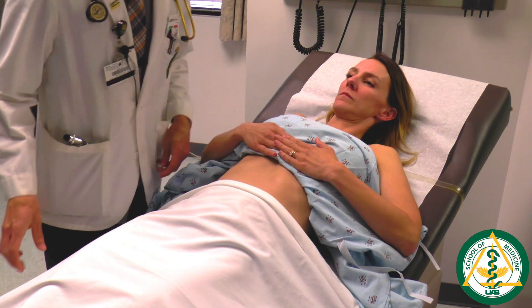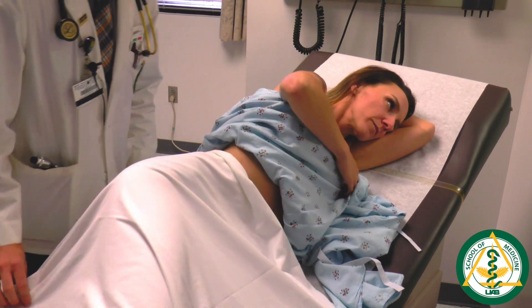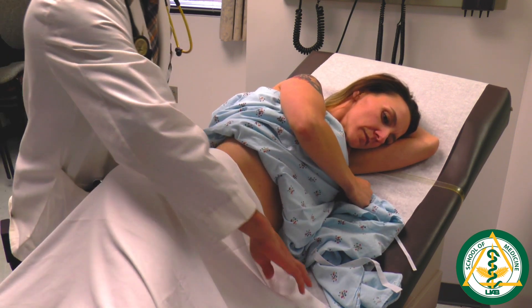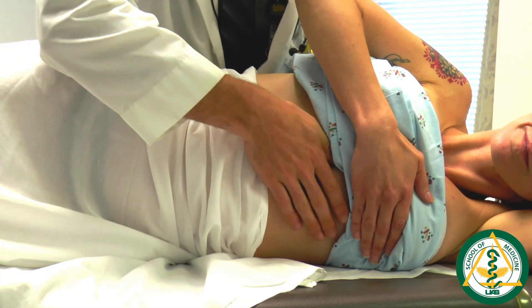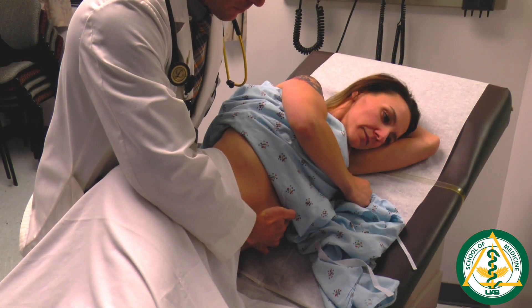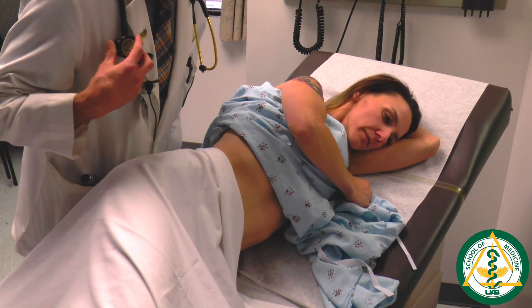To rotate the patient, ask them to turn onto their left side and put their arm beneath their head, while holding the blanket in place as they rotate. In that position, feel in the same area for the strength of the PMI. Once identified, use both sides of the stethoscope to listen to the mitral area.